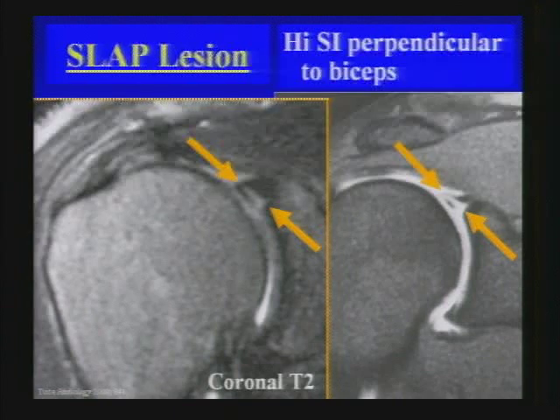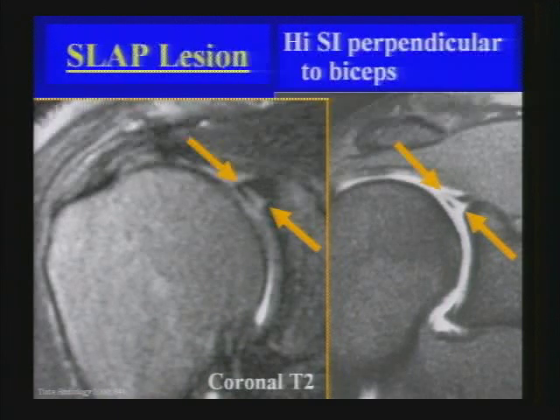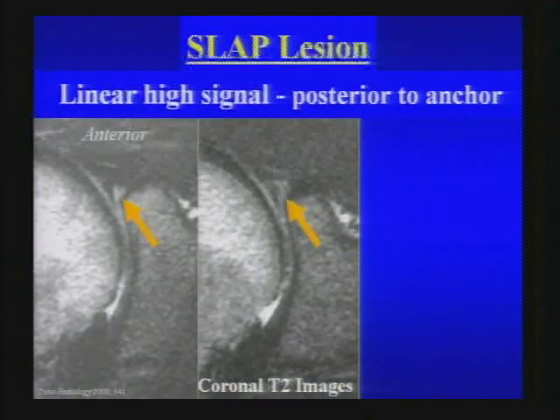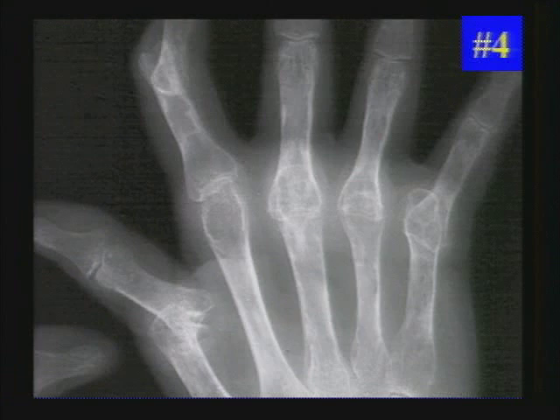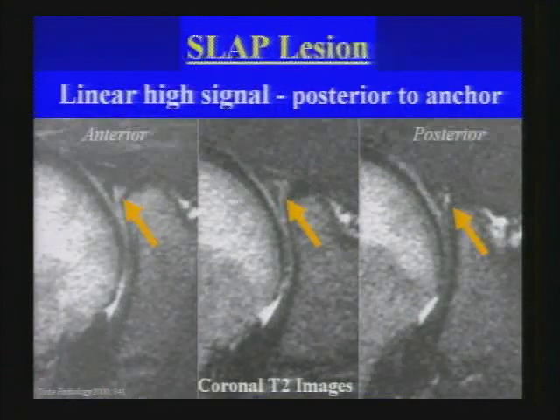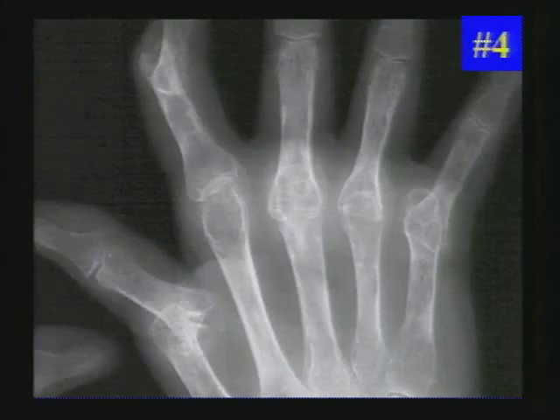Whether on an MR arthrogram or a non-arthrographic study, this abnormal perpendicular high signal allows us to suggest the diagnosis. The other helpful diagnostic criterion is linear high signal extending posterior to the biceps anchor. There are many variations in the anterosuperior quadrant of the labrum, but if you see high signal extending posterior to the labrum, you are dealing with a labral tear. Also look for a paralabral cyst.